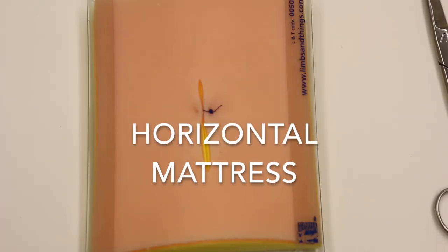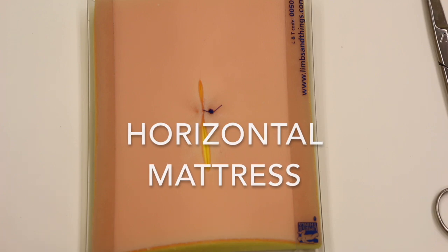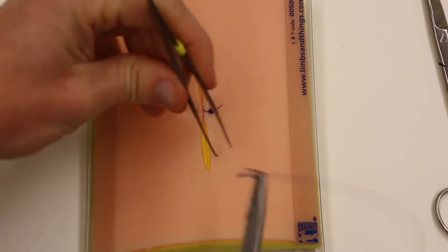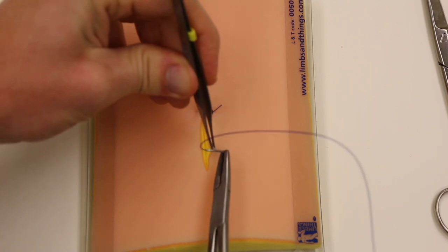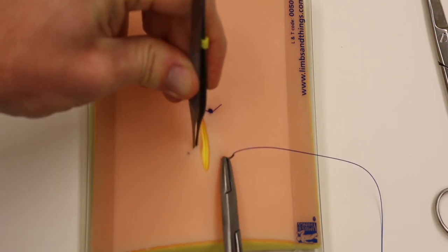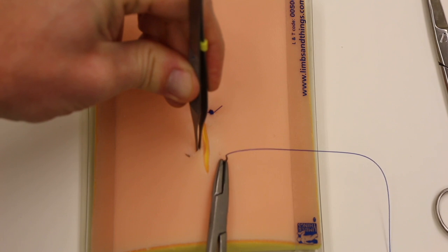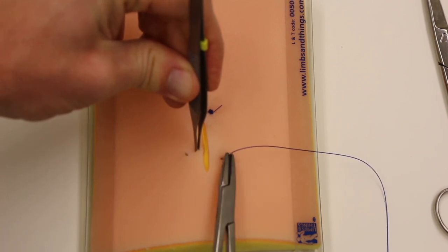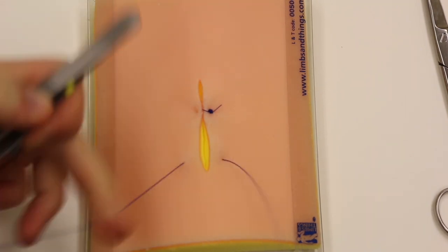And now we'll show the horizontal mattress. So for that, we're going to go a reasonable distance back from the skin edge. Coming out the other side here at about the same distance. So roughly equal. Pulling through.